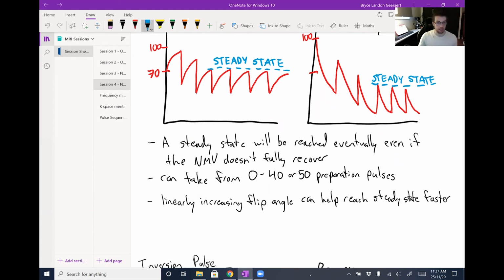So what I mean by linearly increasing is the flip angle, which is frequently described with an alpha symbol. For the first pulse might be like 3 degrees, very short, or a very, very small tip. And then next time you tip it, it'll be 6. And next time after that, it'll be 9. And it's not necessarily always the same. Let me just scroll down my notes to pull up the list of values from the text.